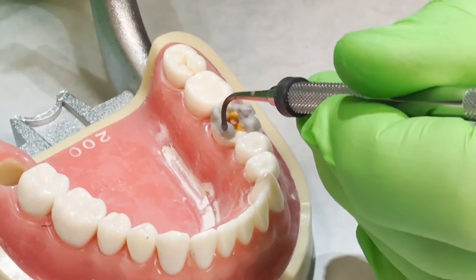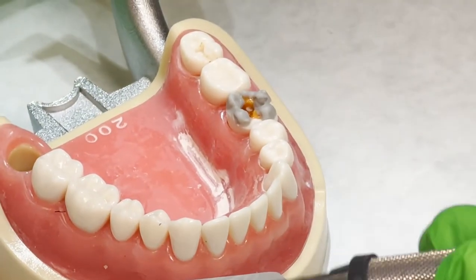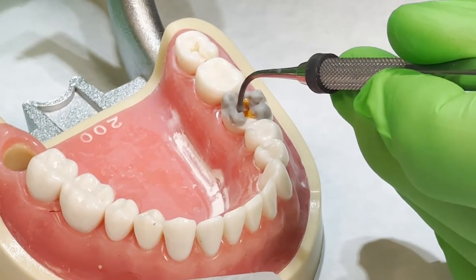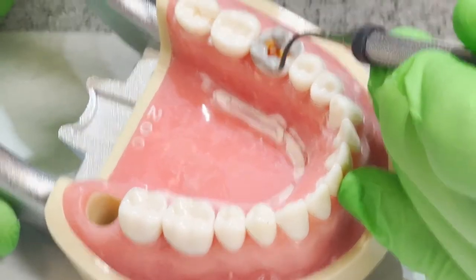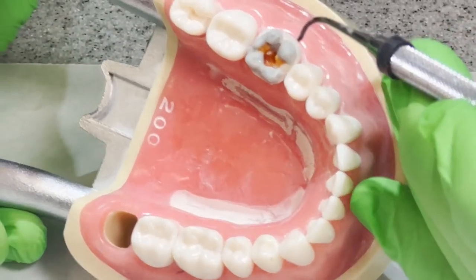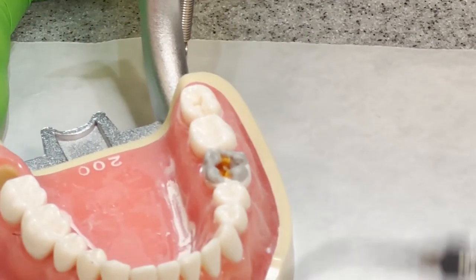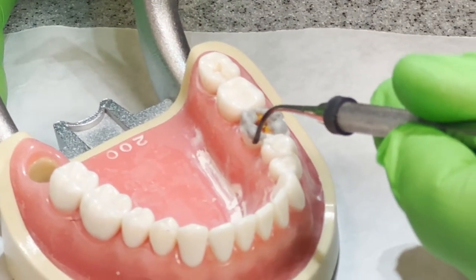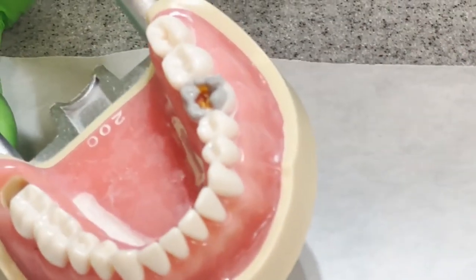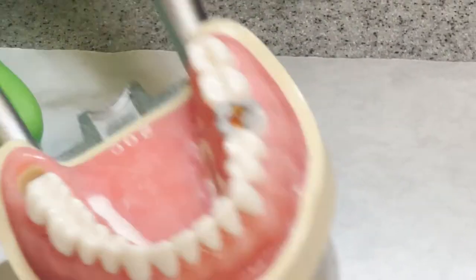Okay. So now I'm just going to try to add and make these cusps look more like a cusp, I guess. I'm hoping I've got that tooth in the right way. Boy, would I be in bad shape if I told you guys to put it in the right way and I didn't do it. Can you see how those lingual cusps are starting to look like a tooth now?